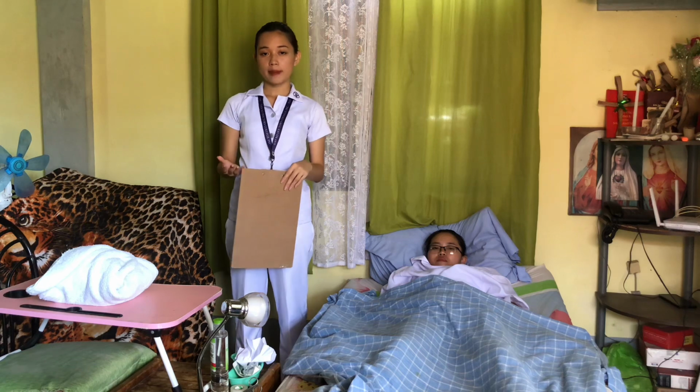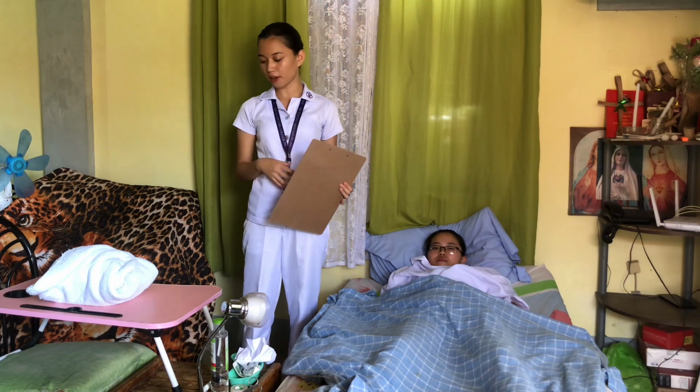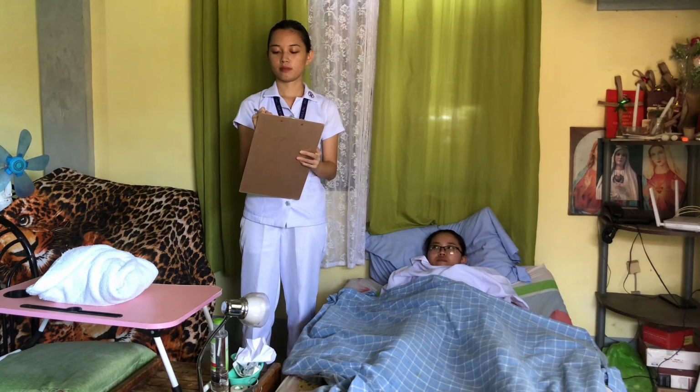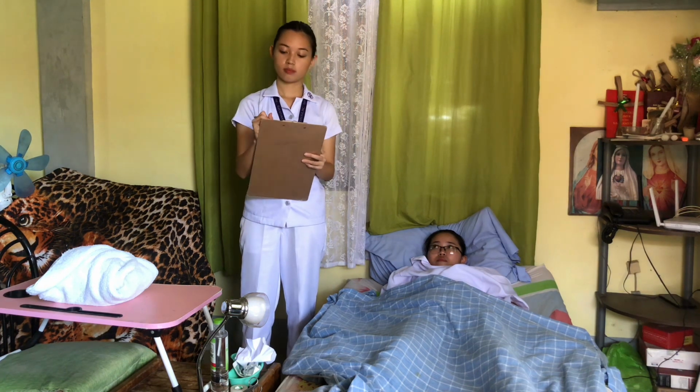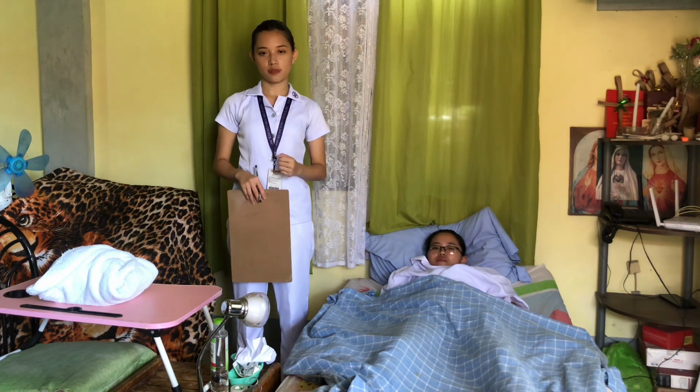So now that we're done, we have to document the procedure. For the documentation of the urinary catheterization, always include the date and time of the procedure, and the type and size of the catheter used. So I used the two-way Foley catheter, latex, silicone coated, in size 16. Also record the amount of fluid used to inflate the balloon. So I used 10 cc of sterile water. We also have to document the character and amount of urine, the reaction and response of the patient, and include other significant observations.